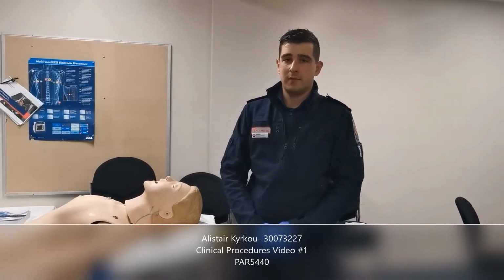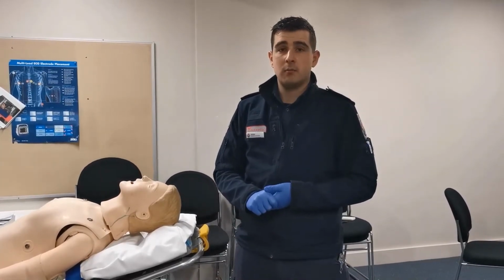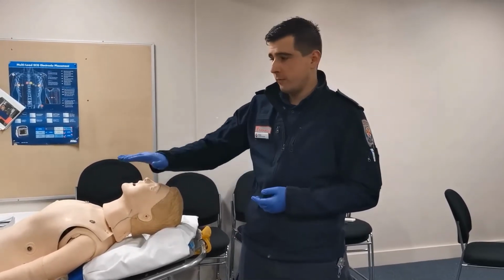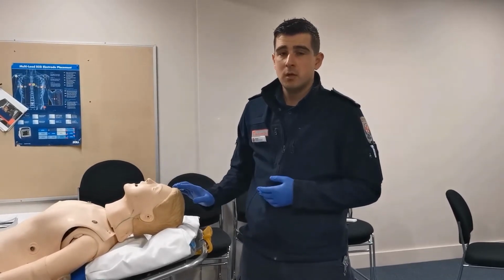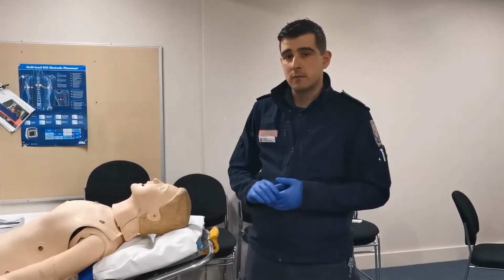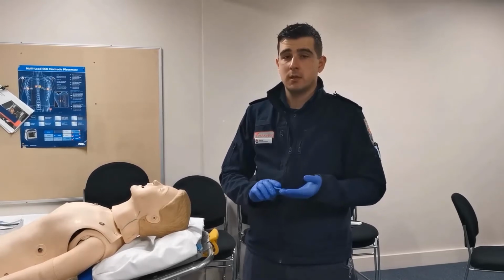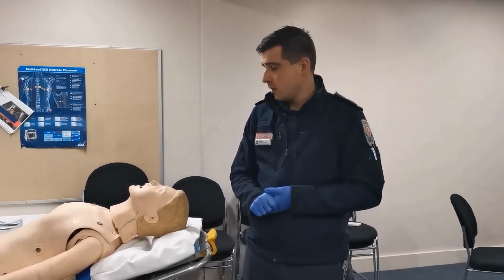This video is for the assessment task number 1, the external jugular vein access. The indications for the external jugular vein access include the emergent access and for the administration of fluids and/or medications where peripheral access has been unachievable. Contraindications include the uncooperative patient due to the location of the insertion site, very dangerous if they're not cooperative, and it should be reserved solely for the critically unwell patient to administer medications, sedation, ongoing fluid and paralysis.